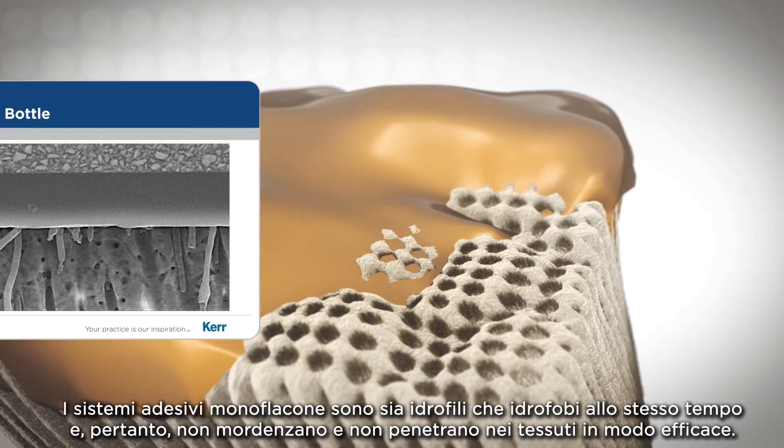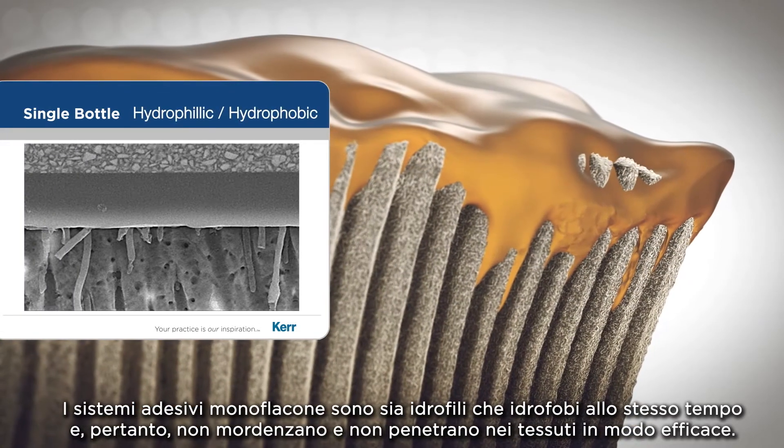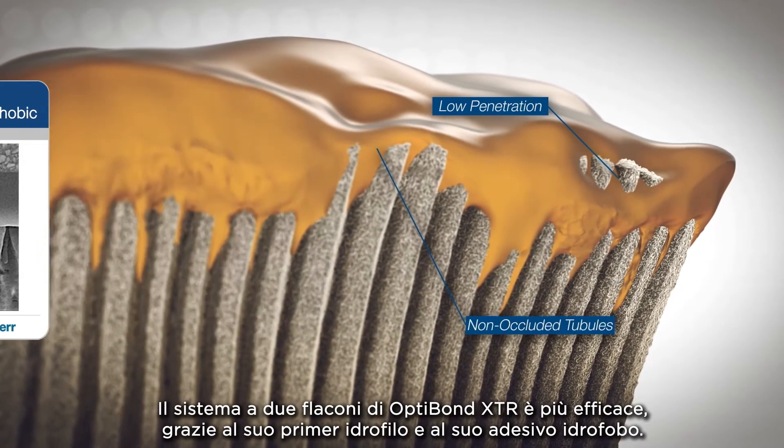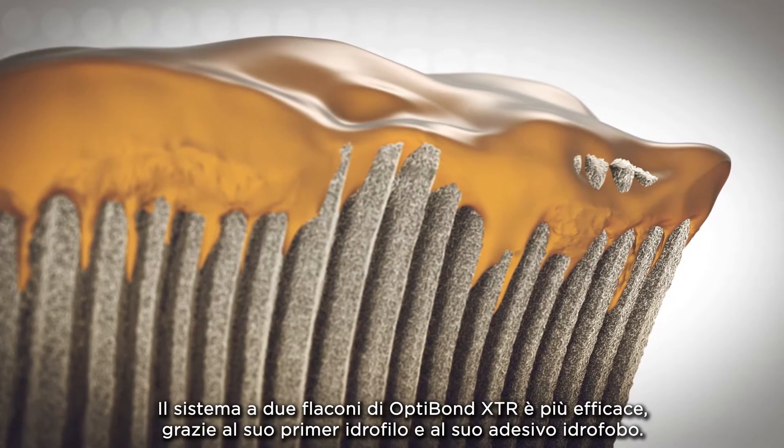Single bottle systems try to be both hydrophilic and hydrophobic at the same time and therefore do not etch or penetrate as well. XTR's two bottle system is more effective with its hydrophilic acidic primer and its hydrophobic adhesive.